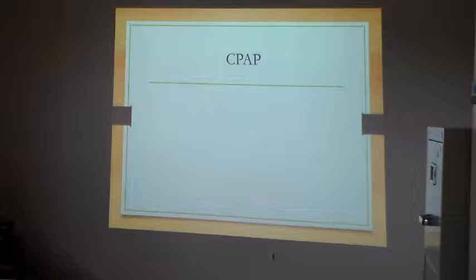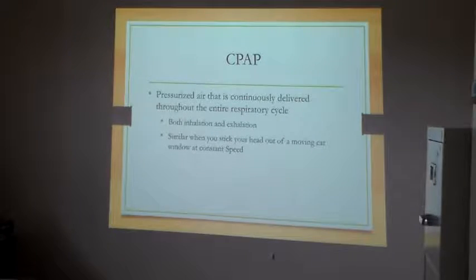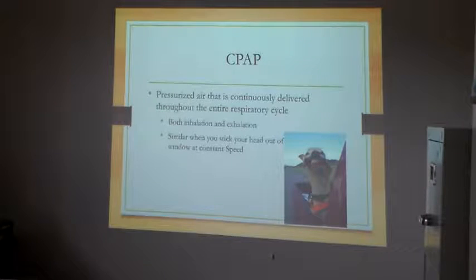Alright, so CPAP, why are we using it? What is it for? This is a pressurized air continuously delivered throughout the entirety of the respiratory cycle. You get one pressure all the time. That's why it's so easy to use. Both during inhalation and exhalation, and it's like you sticking your head out the window as you're driving down the street at a constant speed.